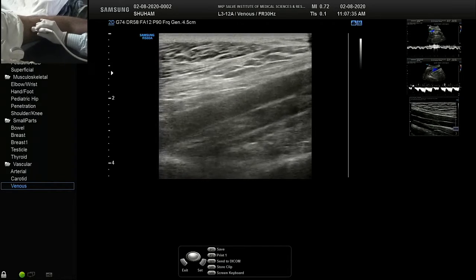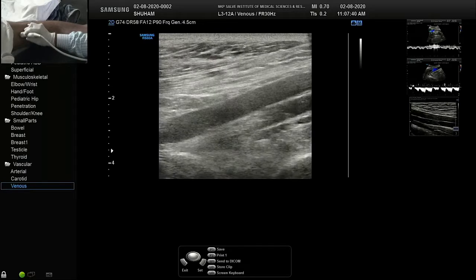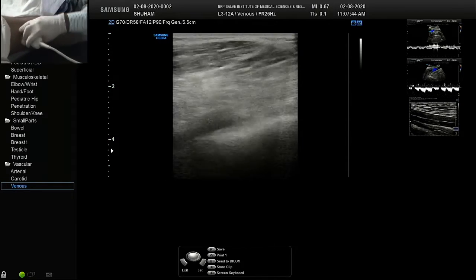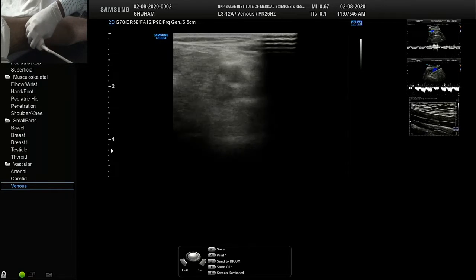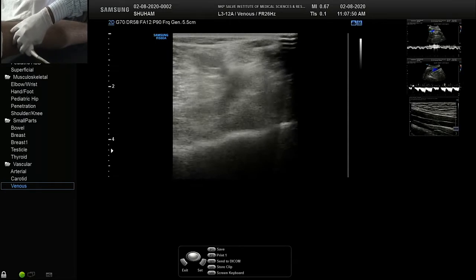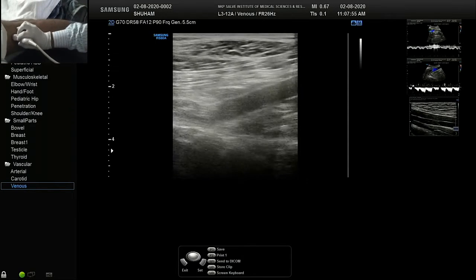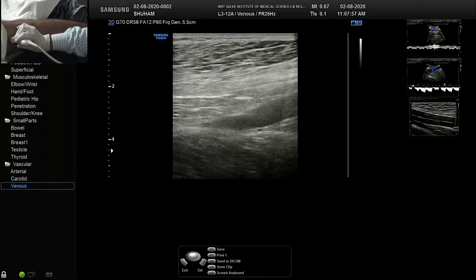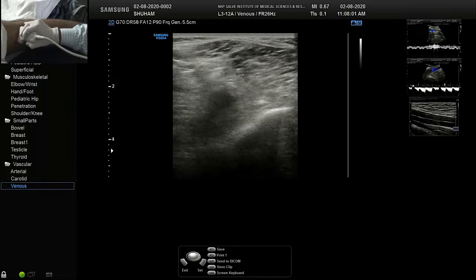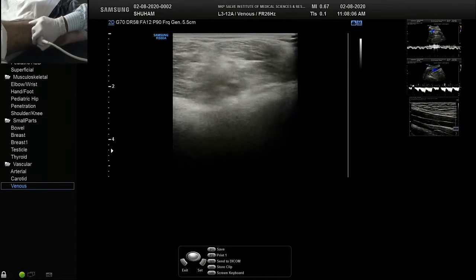So we'll confirm what we were seeing there. Get the focus down. We could just see the short saphenous, but since it is not very prominent, it is not seen. So we can take it as normal. Unlike the saphenofemoral junction, saphenopopliteal junction evaluation is sometimes or many times not possible, just because the vein is either rudimentary or it doesn't carry much blood there.